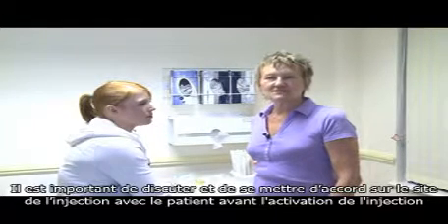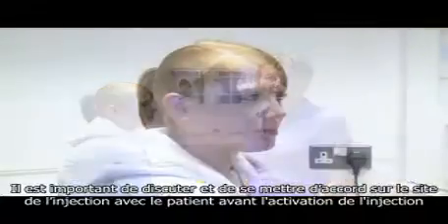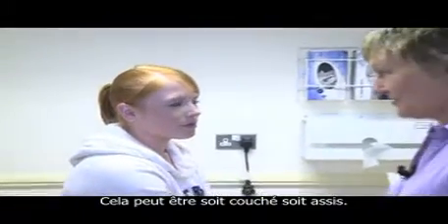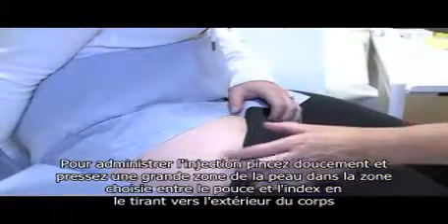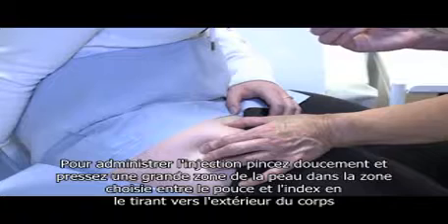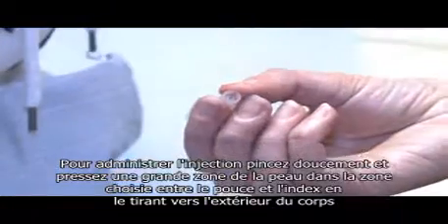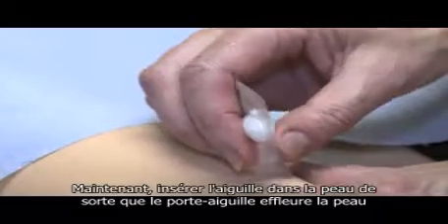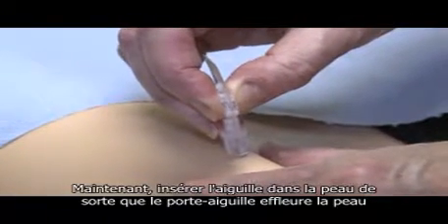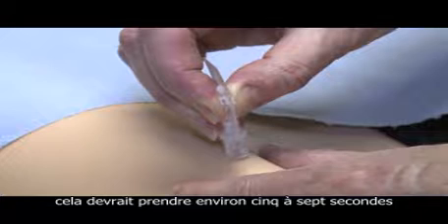It's important to discuss and agree the site of the injection with the patient before activating the injector. This can either be lying down or sitting. To give the injection, gently grasp and squeeze a large area of skin in the chosen area between the thumb and forefinger, pulling it away from the body. Hold the injector by the port and keep it as vertical as possible. Now insert the needle into the skin so that the needle tip is in the subcutaneous tissue and the port just touches the skin. Holding the reservoir firmly between thumb and forefinger, squeeze the reservoir slowly to inject the medicine. This should take about five to seven seconds.